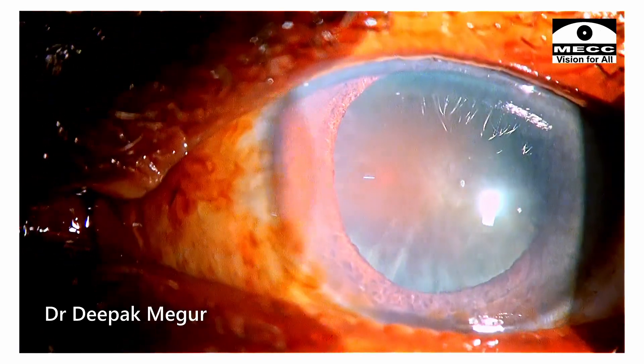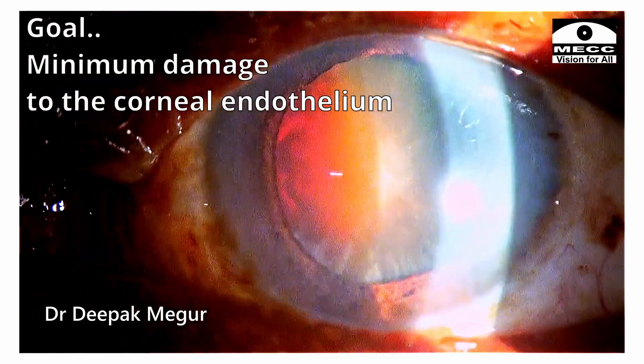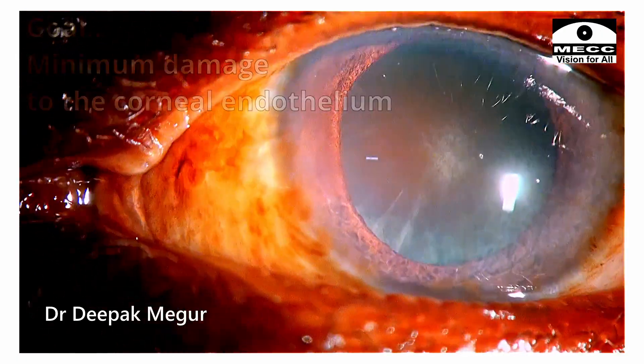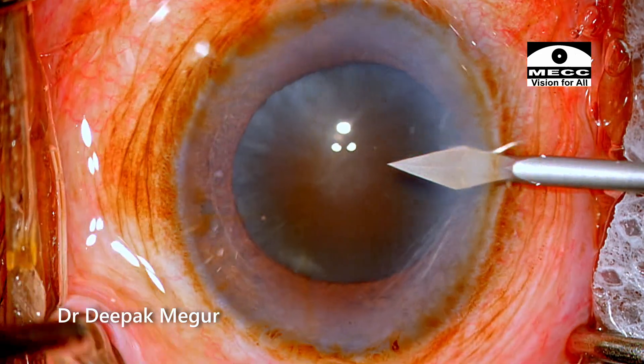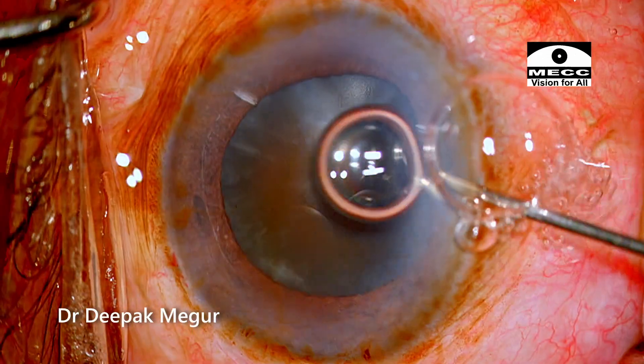After some thought, I decided to go ahead with phacoemulsification as the surgical procedure, with a clear goal of performing the surgery with minimum damage to the endothelium. To counter the deep-set eyes, I decided to give a peribulbar block, which would also prop up the eye a little and provide solid anesthesia, as I was expecting a long surgery in this patient.